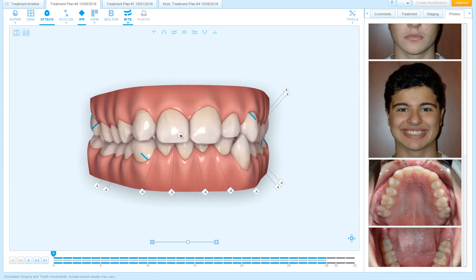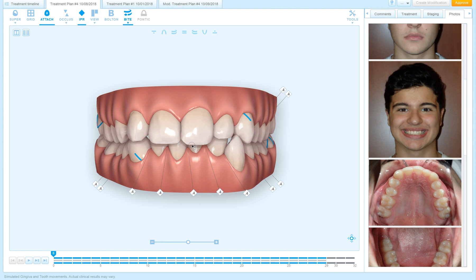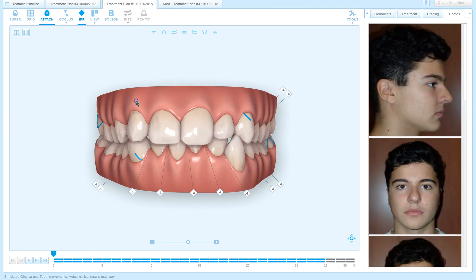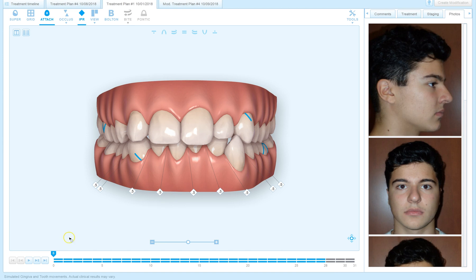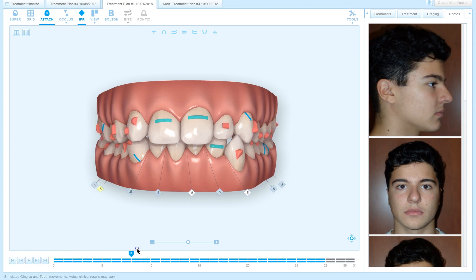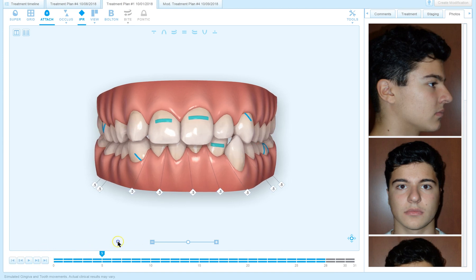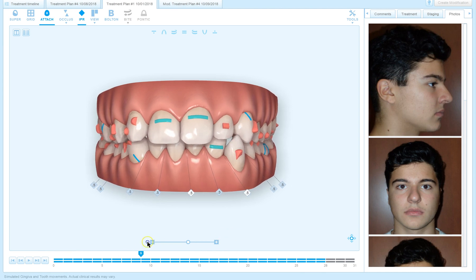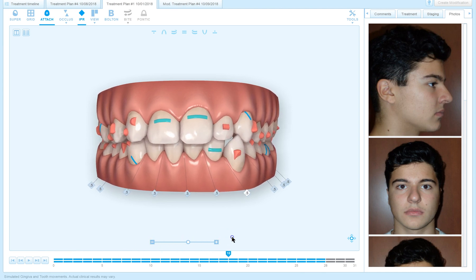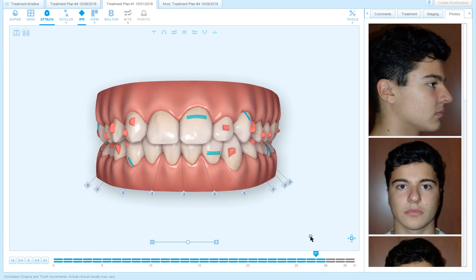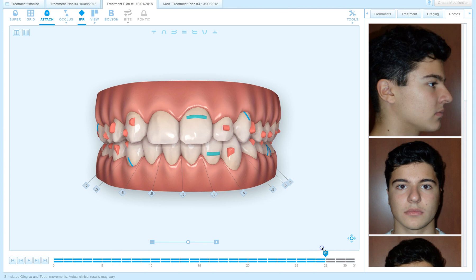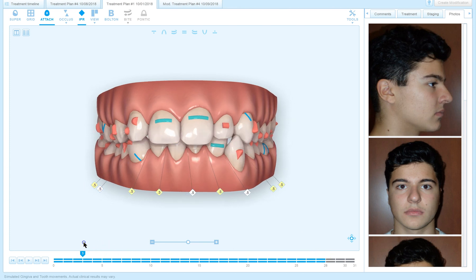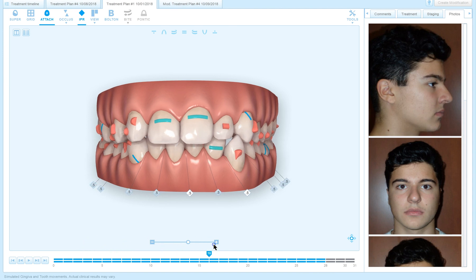Now here in this ClinCheck is where it started, so treatment plan number one, the first one that I received from Align, wasn't really my plan. You can see here the upper midline stayed still, the lower midline was moved to the right side with a lot of IPR. The lower midline moved over to the right and that didn't make sense for my patient, so I had to make some changes to the ClinCheck plan.